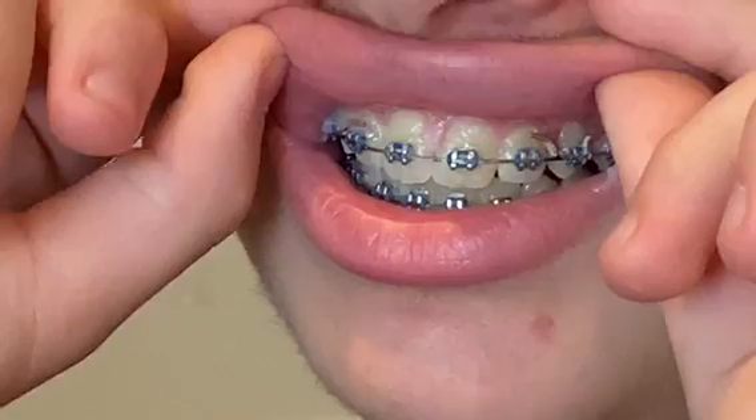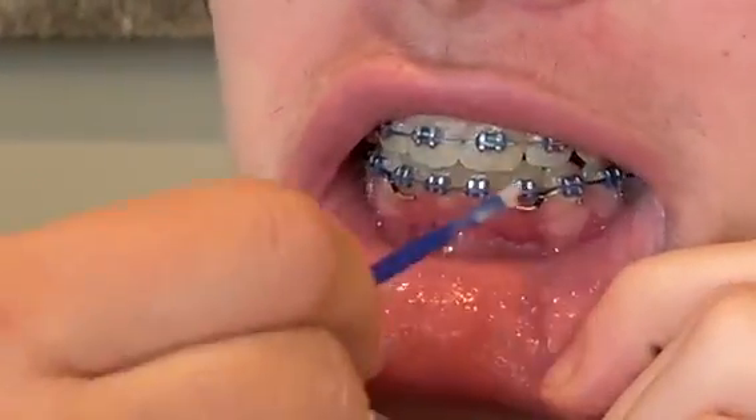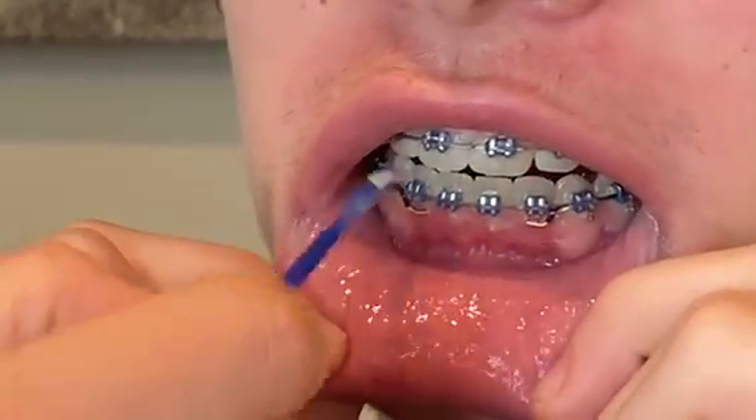Have your child roll down their lower lip. You want to put it again between the brace and the gum.